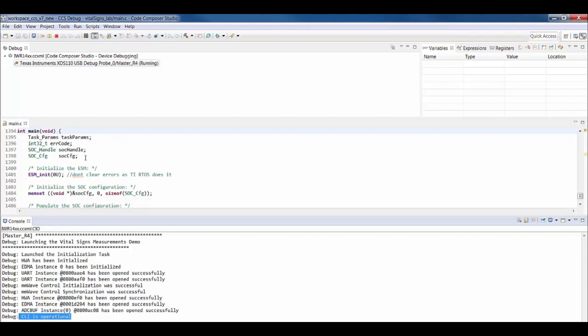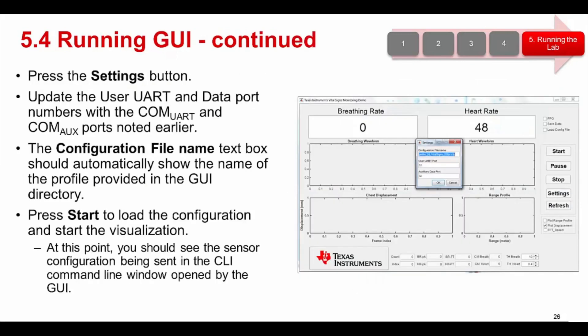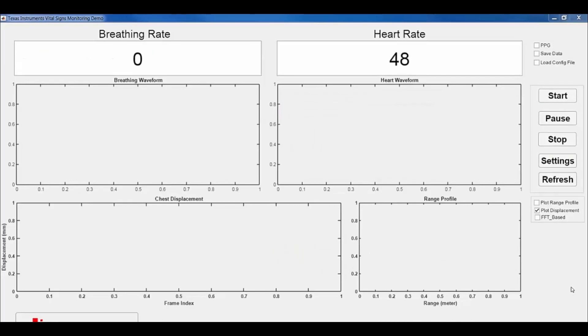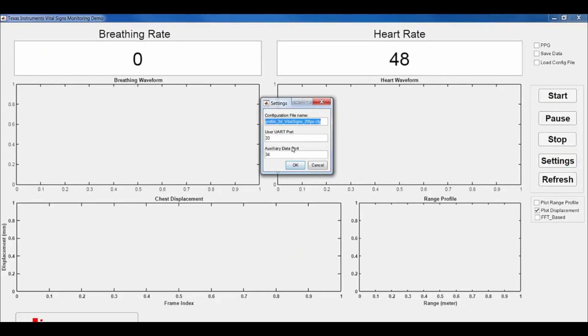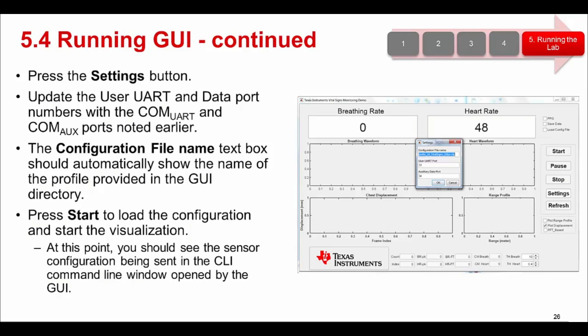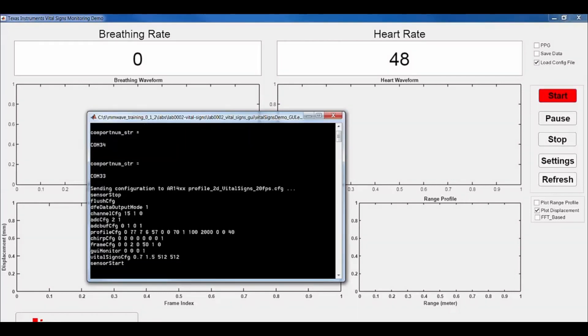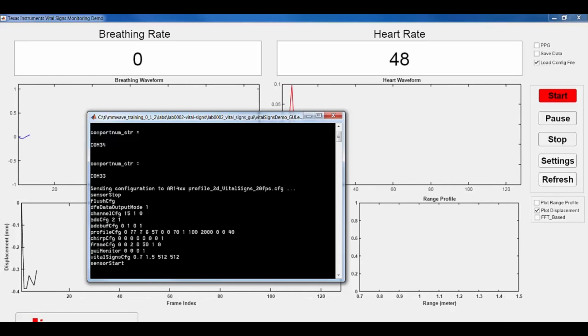Now we are ready to execute the Lab GUI. This is available in the Lab GUI directory under the VitalScienceLab. Open the GUI executable file and once the GUI window opens, press the Settings button, which will open up a dialog box. In the dialog box, update the user UART and data port numbers with the ones corresponding to your local machine. The configuration file name text box should automatically be filled with the name of the default profile provided in the GUI directory. Press Start to load the configuration. Also make sure that the Load Config File checkbox is checked while loading the configuration file. At this point, you should see the sensor configuration being sent in the CLI command line window opened by the GUI.